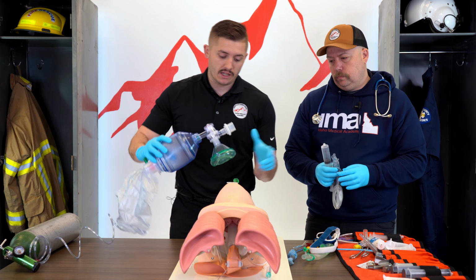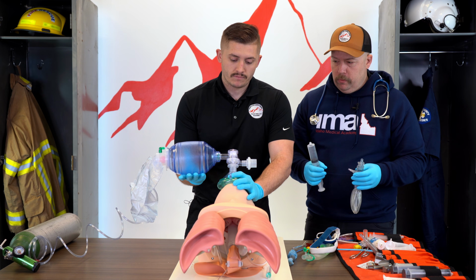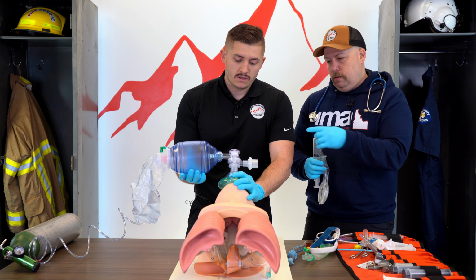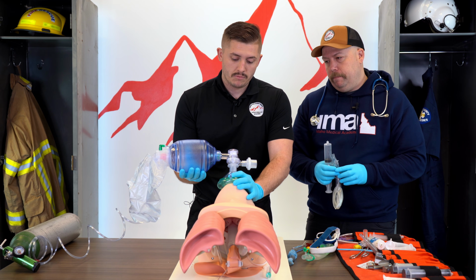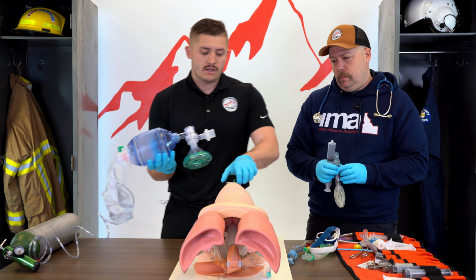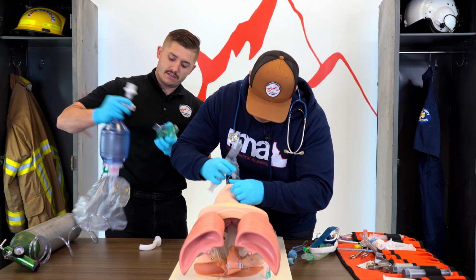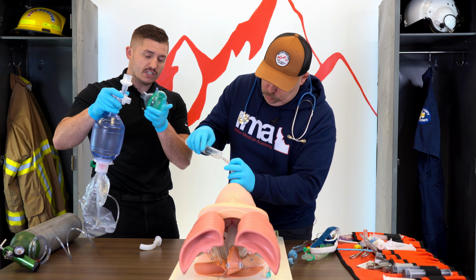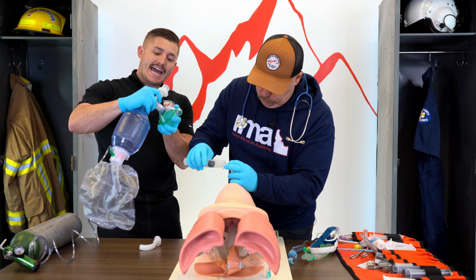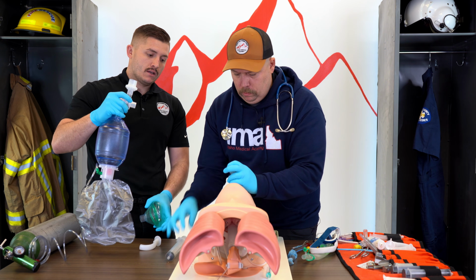So this is what it would look like. All right, Chris, you just tell me when you're ready. All right, we'll give it one more breath, and then we'll have you pull out the OPA, and I will place the LMA. Copy that. Here's my last breath. OPA is out. All right, I'm taking off the mask. My BVM, I'm going to keep this in my hand. If for some reason this doesn't work, I can quickly reattach it. My NPA is still there, and I can begin breathing.